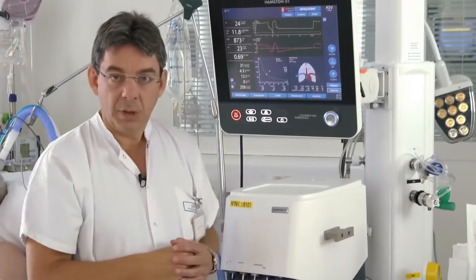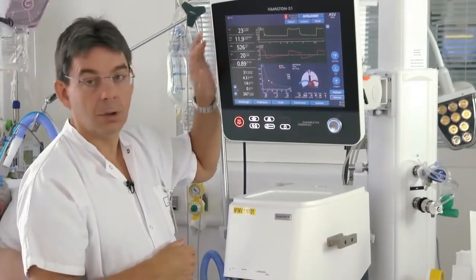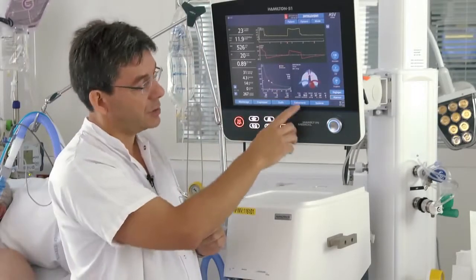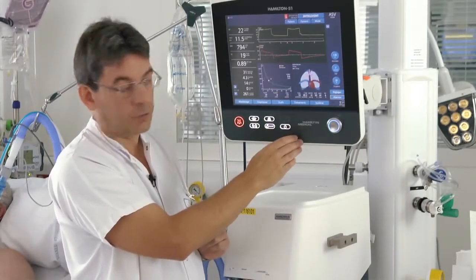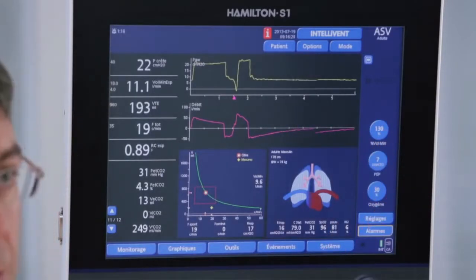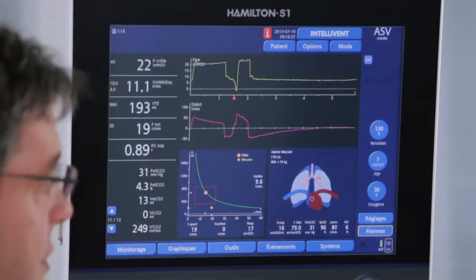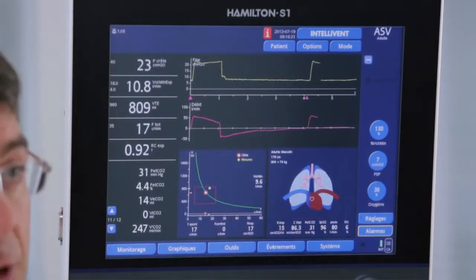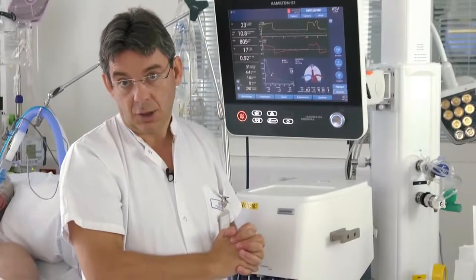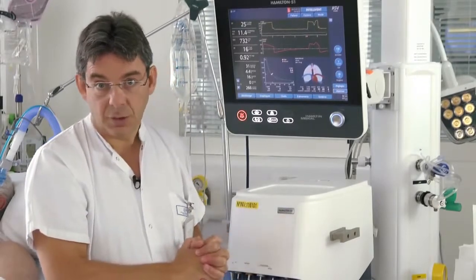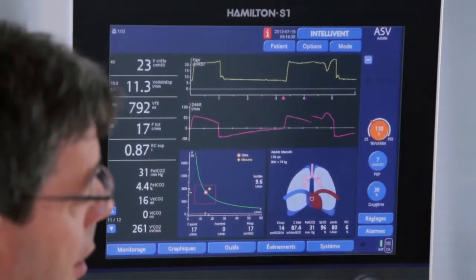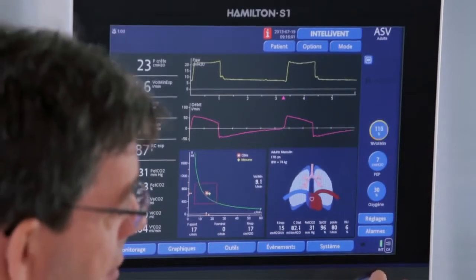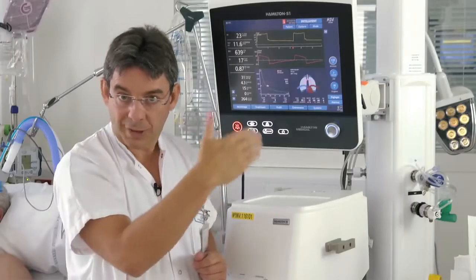When we want to wean with ASV, what we have to check is the pressure support currently used for the patient. With a target minute volume of 130%, the pressure support is 17 cmH2O. We can start to wean the patient by decreasing the target minute volume, usually by 20% steps at a time.